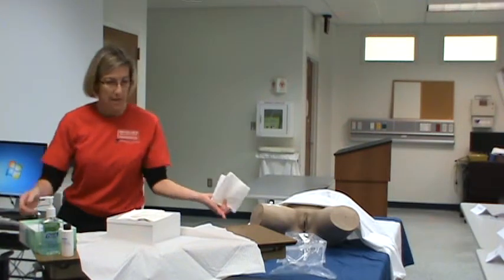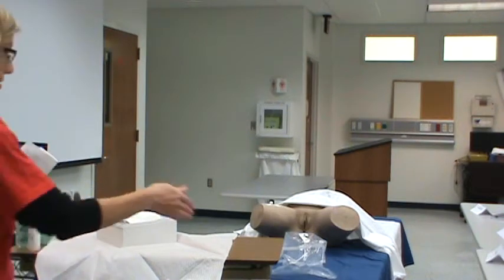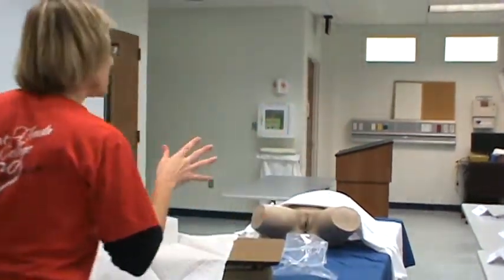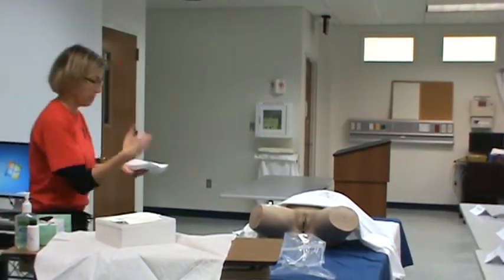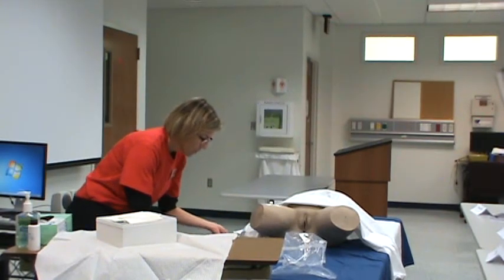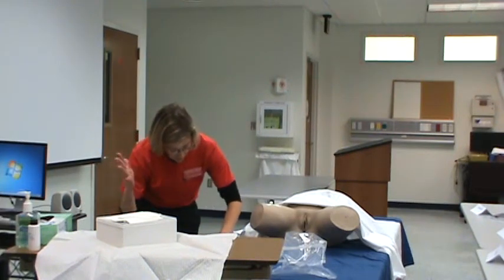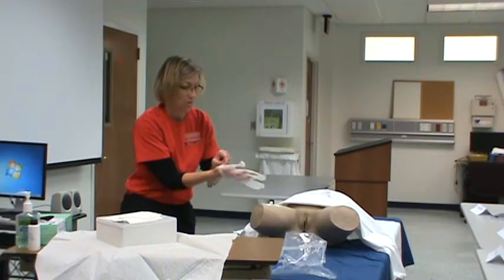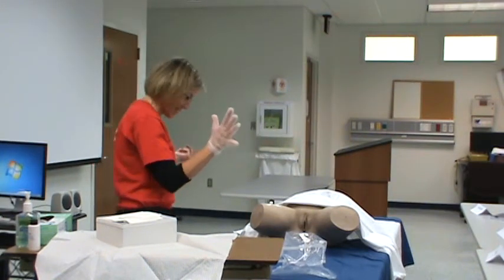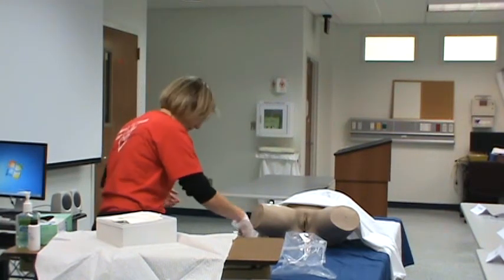But I've got my gloves, and that's what's important. Now, I don't necessarily want to turn my back to you, but this is the edge I would use when I'm in the room to put on my gloves. But for the time being, so that I'm not occluding your view, I'll place my gloves on this way. I'm right-handed, so I'm going to start. And these are enormous gloves, and they're going to be enormous on most of you.